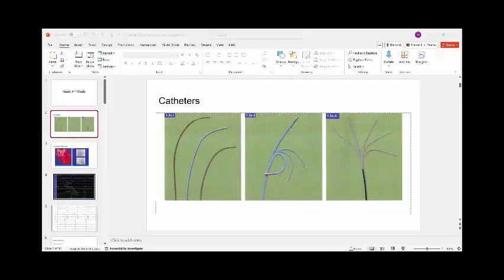Now we'll go rapidly to some basic ECG review. Here, a rapid review of causes of supraventricular tachycardia. We have normal sinus rhythm with sinus tachycardia, and it will be apparent on ECG with a clear P wave.